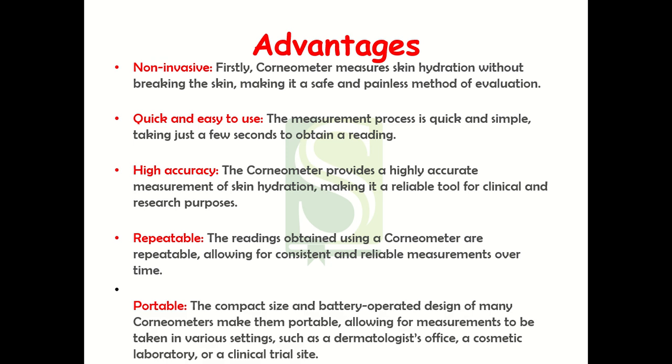Another advantage is repeatability. You can repeat your measurements and you will find that the measurements are consistent, they do not vary. It is portable, as we have seen in the image of the corneometer. It is a very small device, battery operated and compact, and this makes it portable. You can carry it anywhere and carry out measurements in various settings, such as a dermatologist's office, a cosmetic laboratory or clinical trial sites.